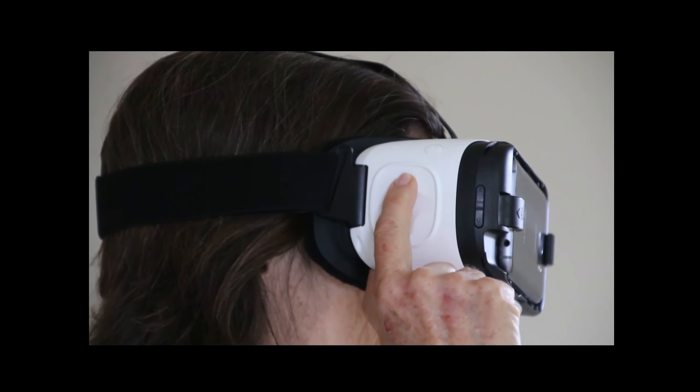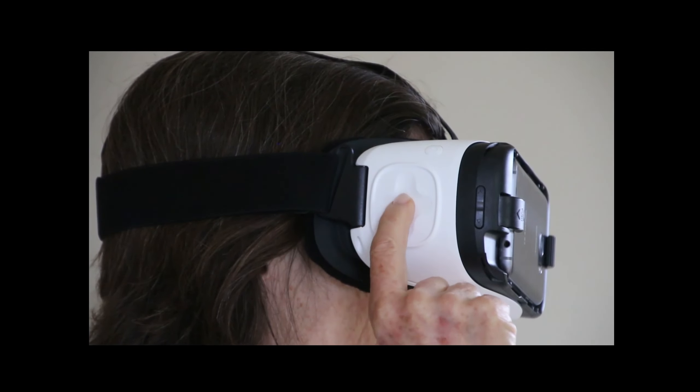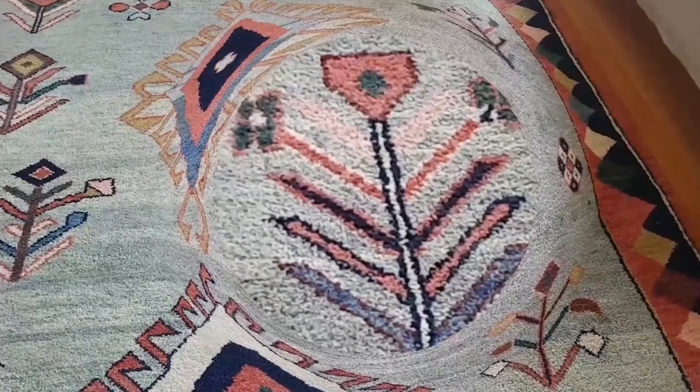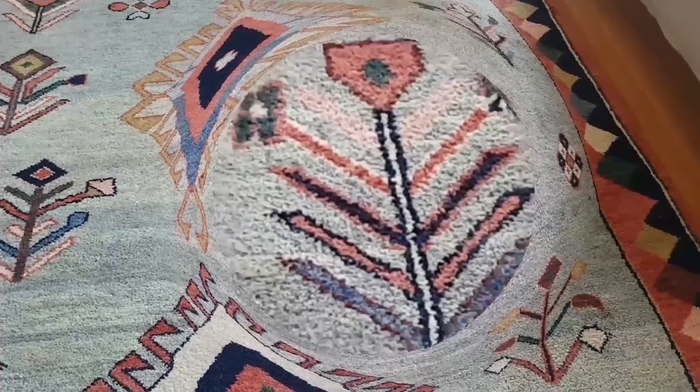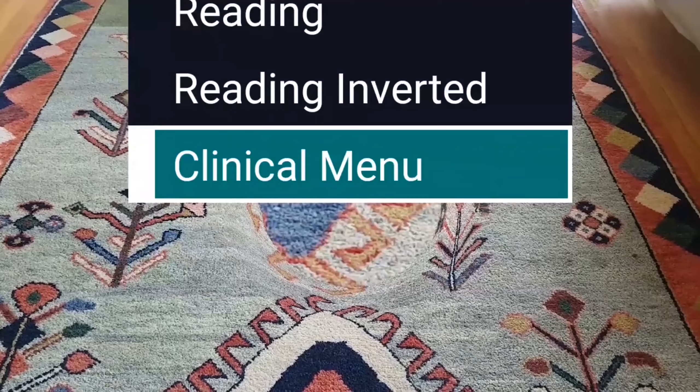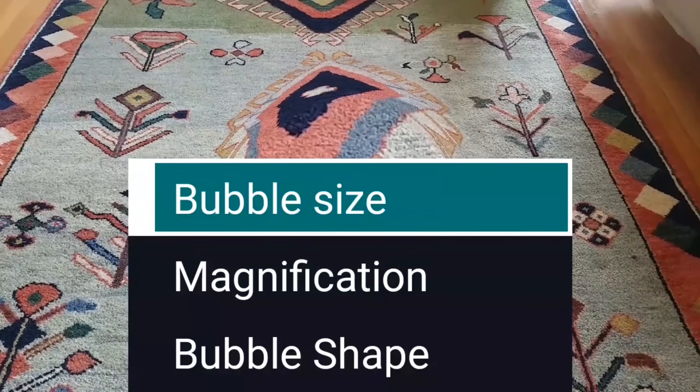Bubble adjustments are made on the touchpad at the side of the headset. Moving up and down changes the size of the bubble, or moving back to increase the magnification within the bubble. An extensive menu allows patients to adjust many of the parameters of the device by using the touchpad on the side of the headset.